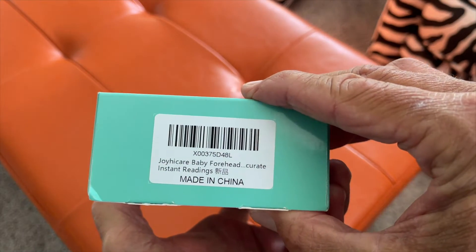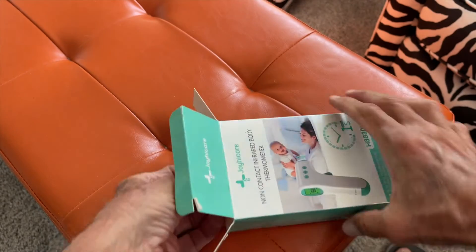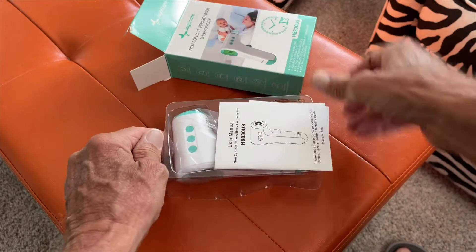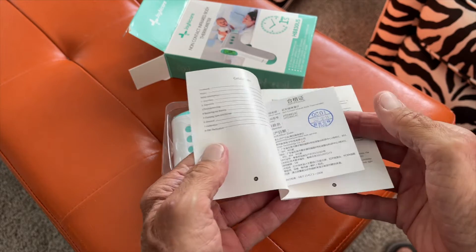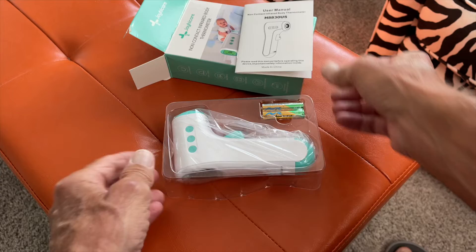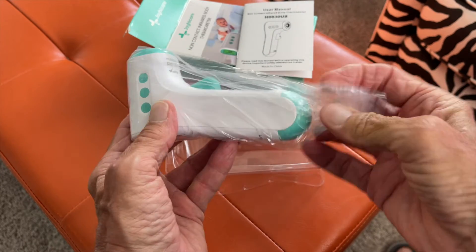That's all of the different sides so you can see it. Let's go ahead and pop this open. It comes in a little plastic case. Here are your instructions — you want to hang on to those. It's also got some kind of certificate in there. Basically, this is a smaller version of the other one that we received.